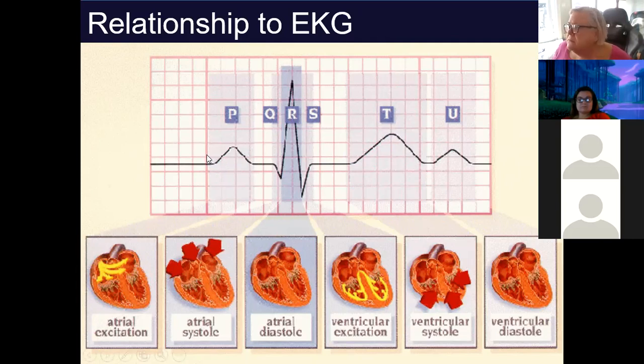I'm just going back to the P wave. It says atrial excitation. Are we ever going to see the word depolarization, repolarization? Yeah, we will. Okay, because that's how I learned it, so that's how I understand it. I have other slides that show that, Sean. All right, so QRS, then the T wave. S is when the ventricle's getting excited, getting ready to do its thing.